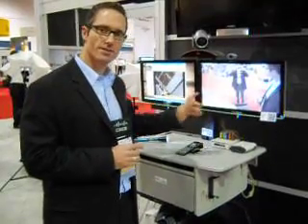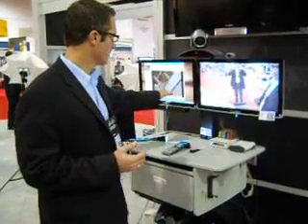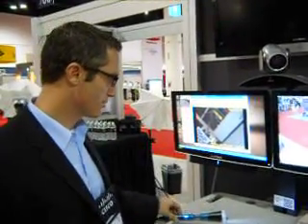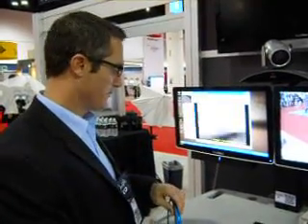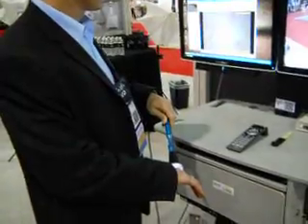We've got speaker bars here, so you can have two-way audio, two-way video. You can see with the camera, we can bring in medical records. Medical records. Okay. We can pull up a lab. This is actually our image capture software, so we're looking at various things like we've got the skin. And that, Jay, is the camera you're holding in your hand right there.